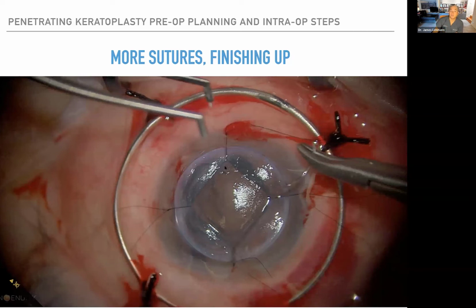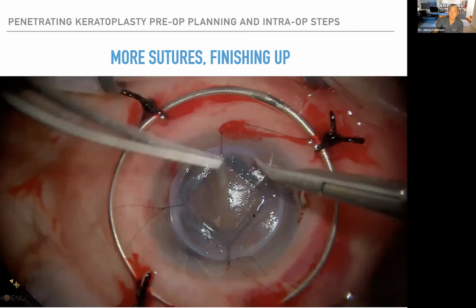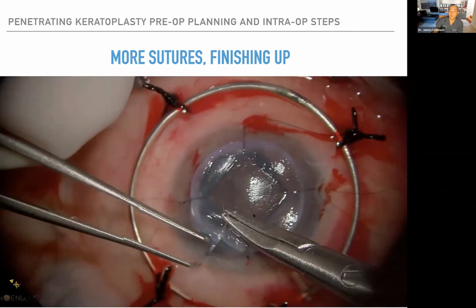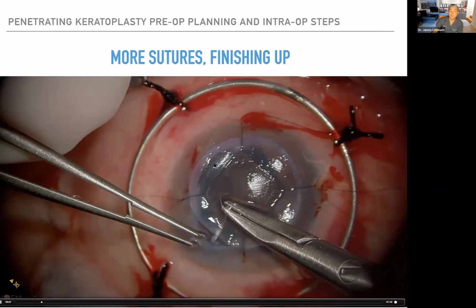So here's the finishing up of the sutures. So we got the 4 cardinal sutures in. This case was done in Myanmar on the Orbis Flying Eye Hospital. And look at that nice diamond. So that's good. And so now I'm going to do 12 sutures, right? So I have 4 of them in. I'm going to do 8 more. So it's going to be 2 in between each of these sutures.